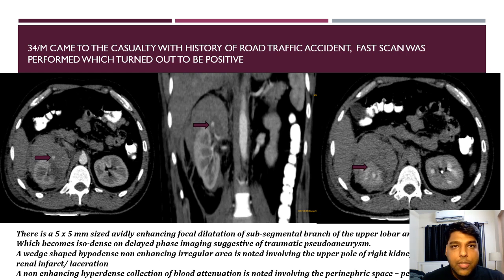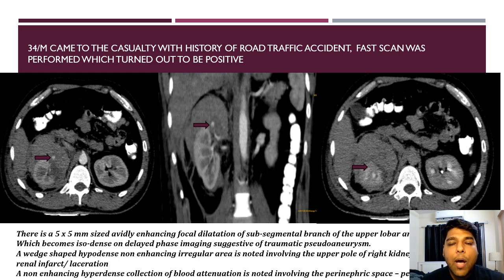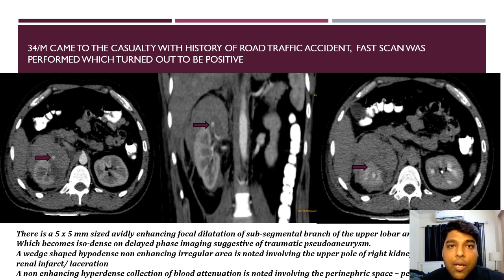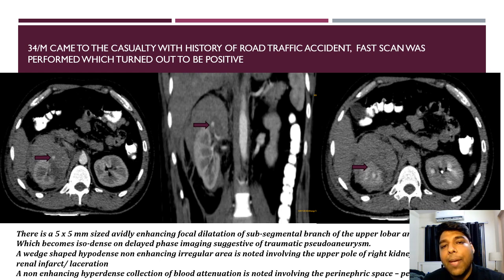Case 1: A 34-year-old male came to casualty with history of road traffic accident. FAST scan was performed which turned out to be positive. There is a 5x5 mm sized avidly enhancing focal dilatation of a sub-segmental branch of the upper lobar artery of the right kidney, which becomes isodense on delayed phase imaging, suggestive of traumatic pseudoaneurysm. A wedge-shaped hypodense non-enhancing irregular area is also noted along the upper pole of the right kidney, suggestive of renal infarct or laceration. A non-enhancing hyperdense collection of blood attenuation is also noted involving the perinephric space, suggesting a perinephric hematoma.